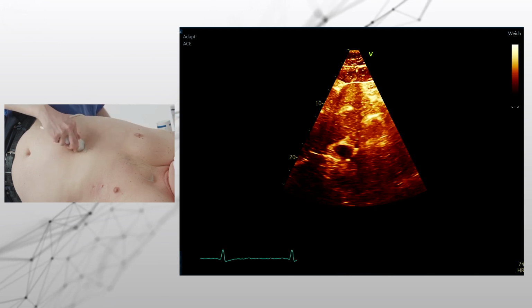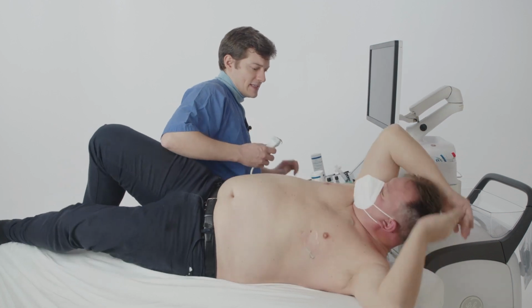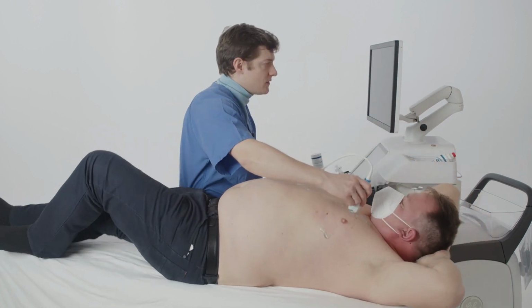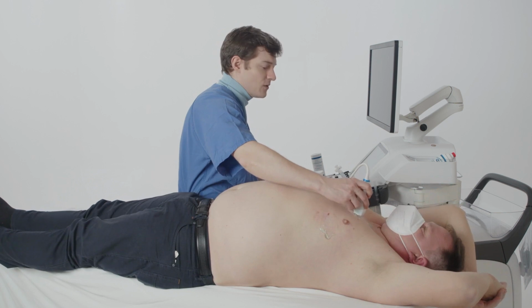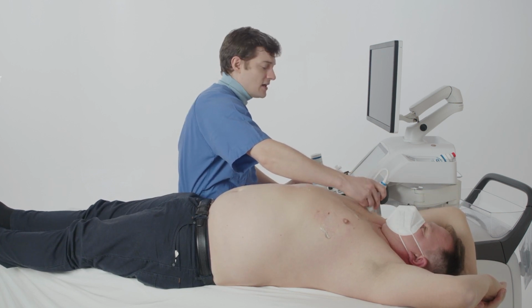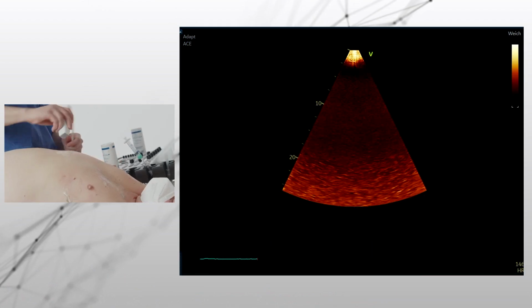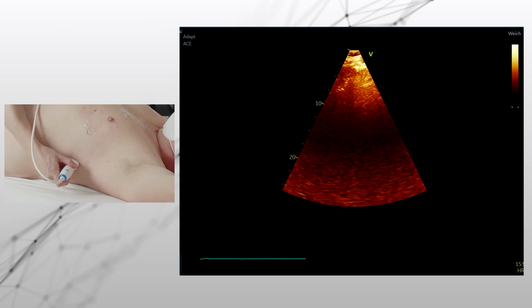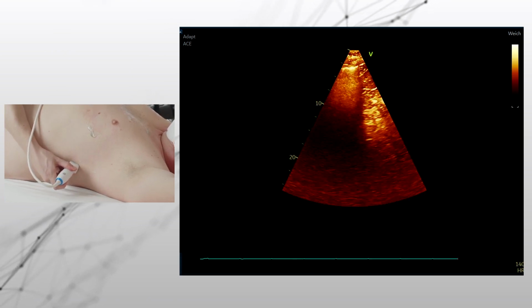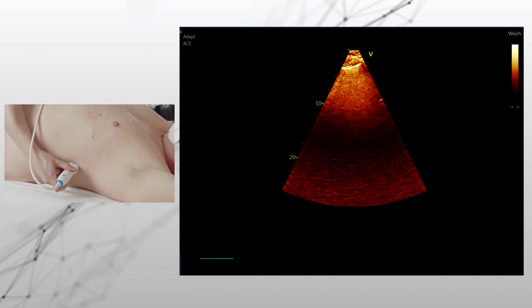Then the last thing we need to do, kannst du am Ruck anlegen bitte? Is scan the lungs. So what we normally do is we scan from anteriorly. We can also use a linear transducer if we have it, or we can simply use this transducer to see artifacts. We do not have any, and then we continue with pleural effusion, which we also do not have. So we would look here for the pleural effusion, left and right side.